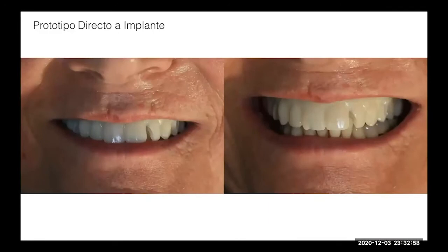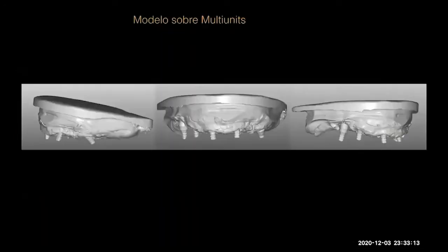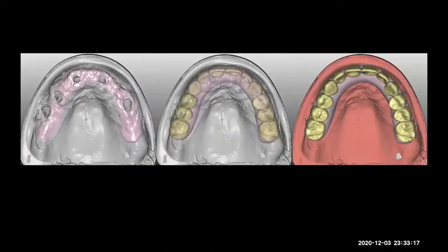We normally do a prototype for this kind of case because we want to know where we need to go. In that prototype, we can show the patient and the doctor that we need to use some components that bring the angulation a little bit lingual, like a multi-unit. So we go back to the lab, we change the plan, we use some multi-units.